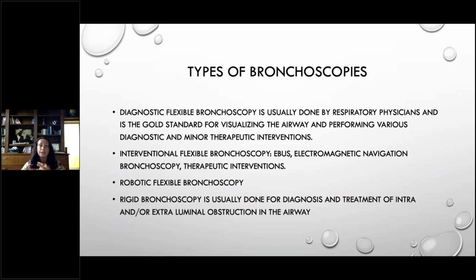On that note, I will move a little bit more towards the clinical presentation. So there are several types of bronchoscopies. There's diagnostic flexible bronchoscopy, which is a standard of care for visualizing the airway. There is interventional flexible bronchoscopy like EBUS, navigational bronchoscopy. There is robotic flexible bronchoscopy now, and there is the old school rigid bronchoscopy, which is usually done for diagnosis and treatment of obstruction or some kind of a foreign body removal.